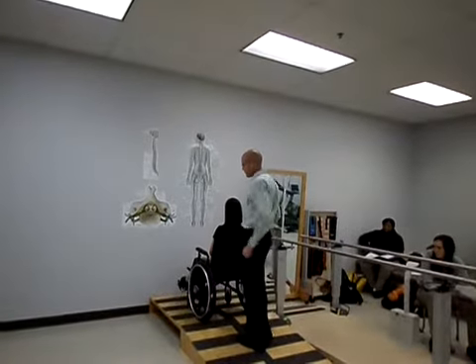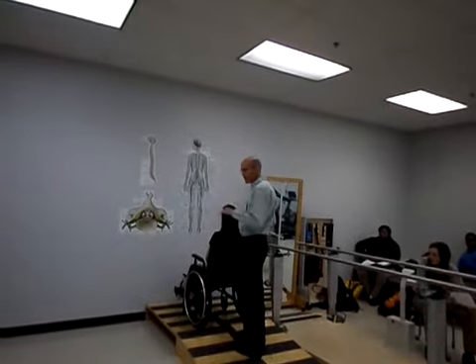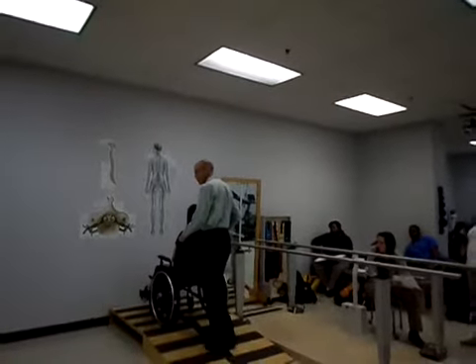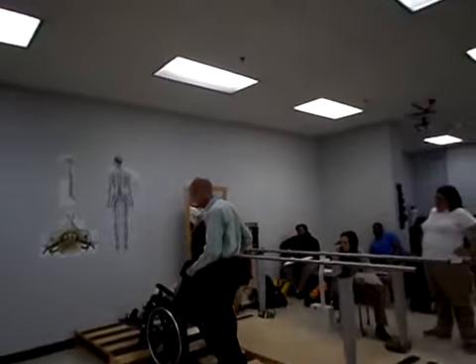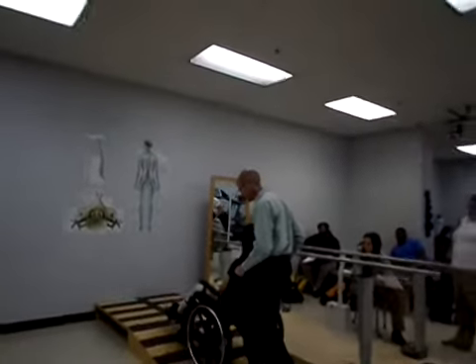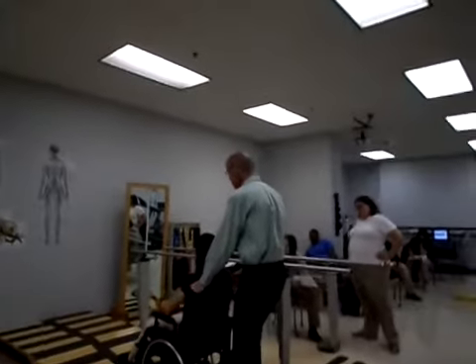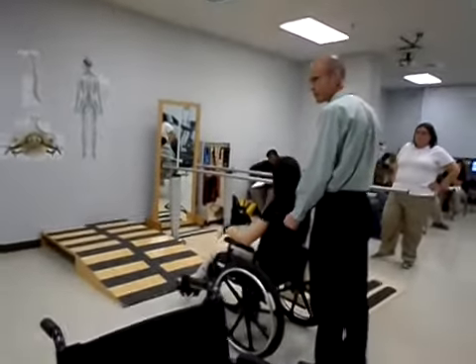Okay, down, forwards or backwards? Backwards, ideally. If I did it forward, I would need to tip her back, and it's going to be harder. So going backwards is a little bit easier with this. Okay. Right behind her. She goes off. Don't let her do that. Okay, and that should be it. Is that it? Okay, thank you very much.